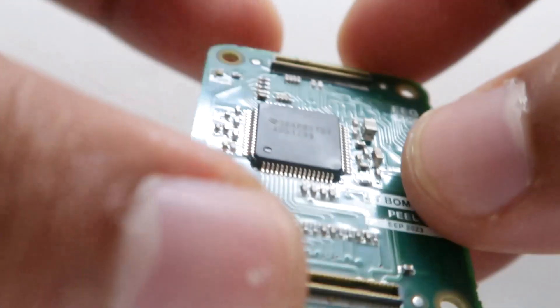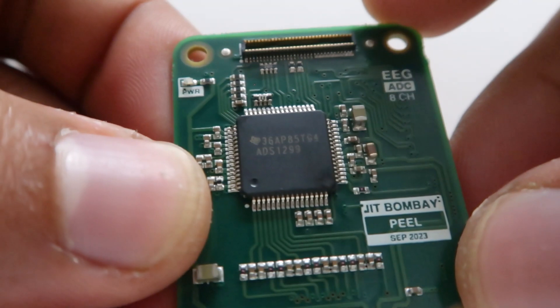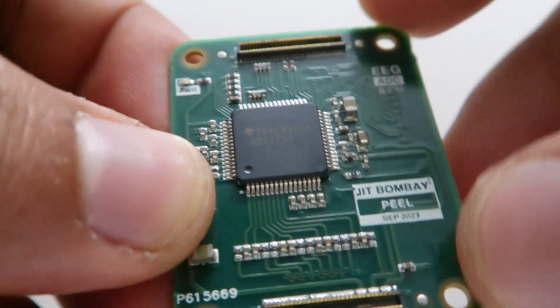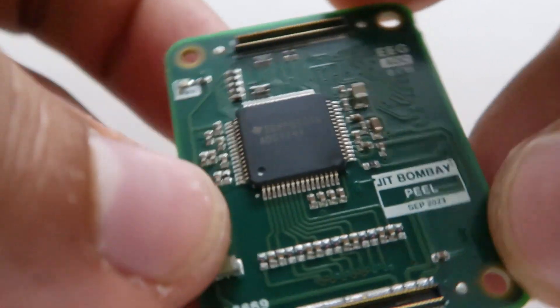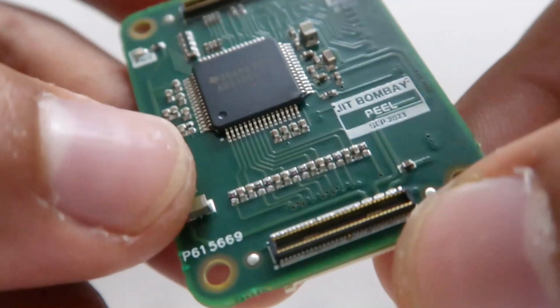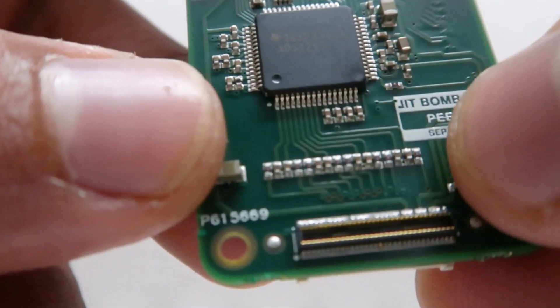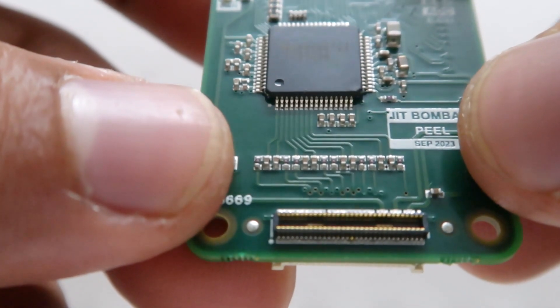Going over to the ADC stack, you're going to find the Texas Instruments ADS1299, which is a very standard ADC for EEG applications. It has the reciprocal DF40 connectors for stacking, and for the low-pass filters we have gone with a cutoff frequency of one kilohertz.